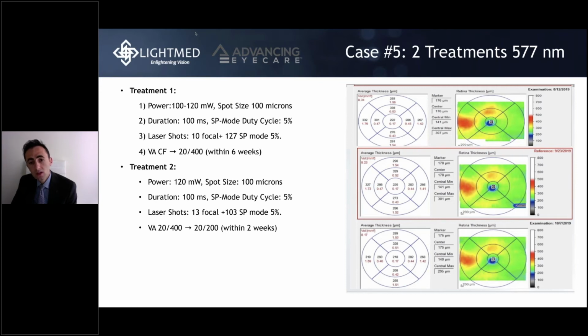And when you look at the map of the OCT, map of the macular thickness, you can see gradual decrease in the center macular thickness, as well as the temporal macula thickening. You can see this island of red, which was hot or elevated, is slowly fading away or getting less elevated and improving.